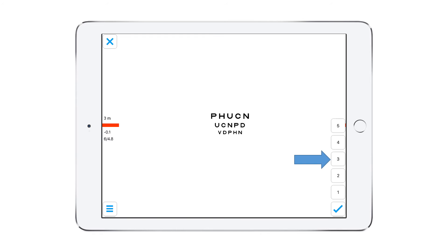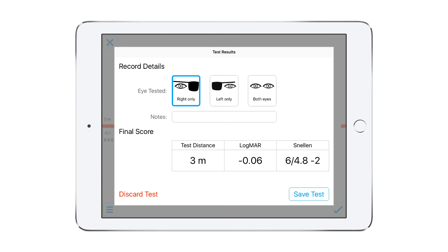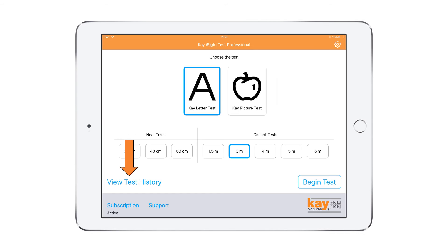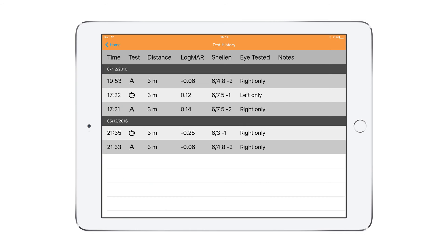At the end of testing, click the tick button and choose the number of letters seen. This will give you your Exact Logmar score, which you can save. This information is kept in the test history in date order.